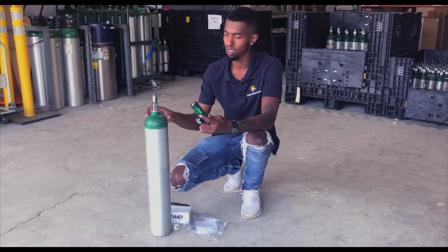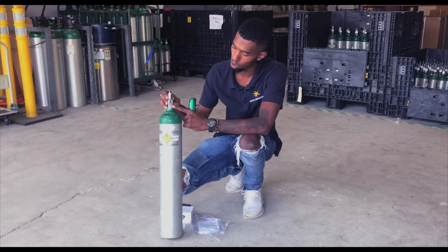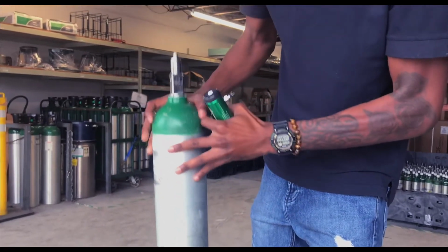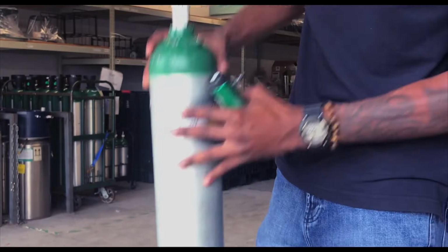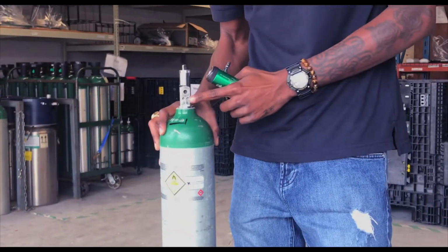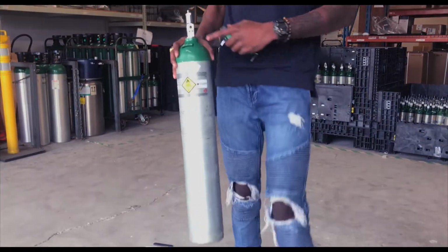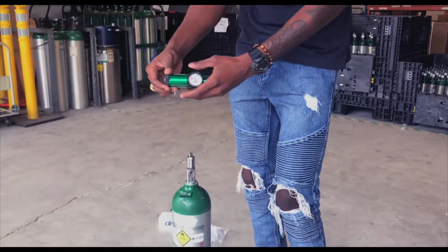So secondly, on your tank you want to find the 2 holes which are located right here. They're not located on this side, they're not located on this side, and they're not located on this side. They're going to be located on one side of the E-tank, so it's easy to find. Okay, so once you've located your 2 holes on your E-tank, you want to look at your regulator.